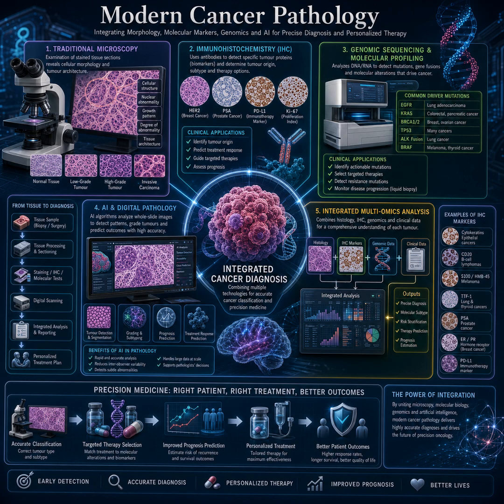S100 and HMB45 are commonly expressed by melanocytes and strongly support the diagnosis of melanoma. TTF1, despite its name, is normally expressed in both lung and thyroid cells, making it an invaluable marker for identifying primary lung adenocarcinomas and thyroid cancers.